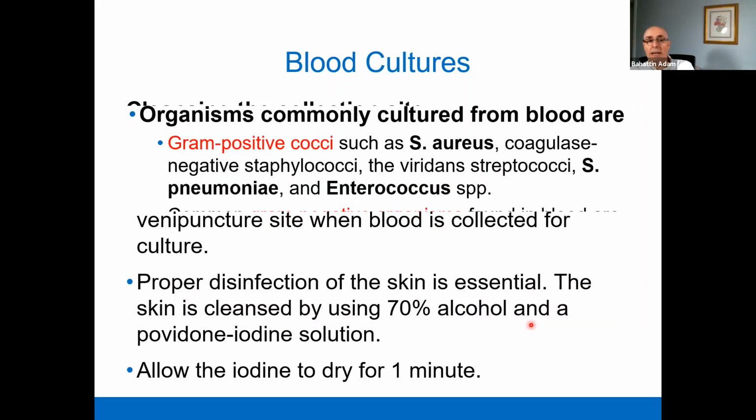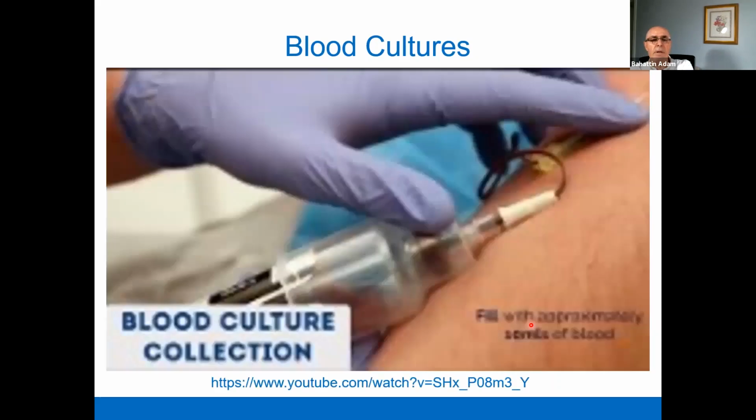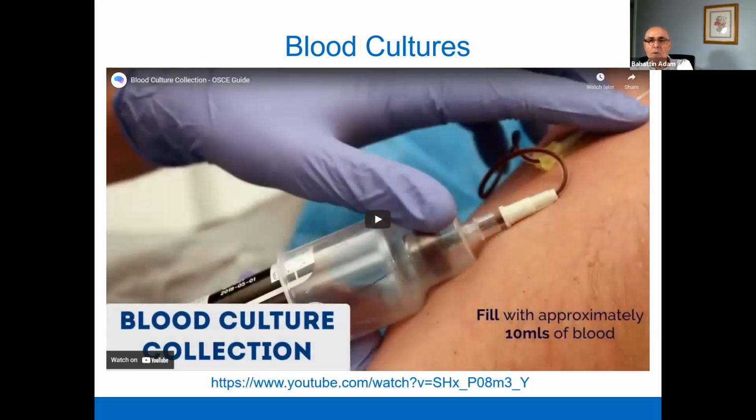First, we have to cleanse the collecting site as if we are performing a surgical operation, using alcohol or some kind of iodine solution, and then allow it to dry for 1 minute, and then withdraw the blood. Now I am going to skip these videos.